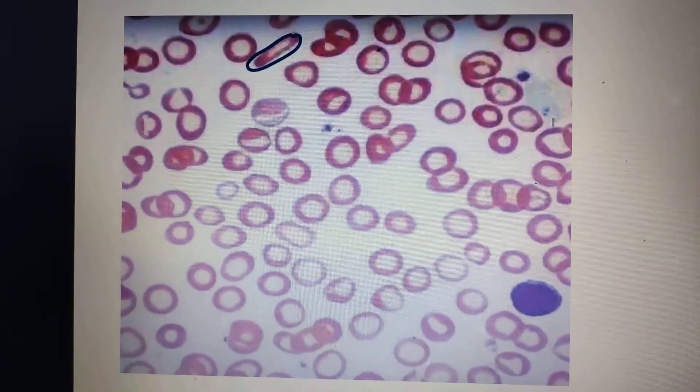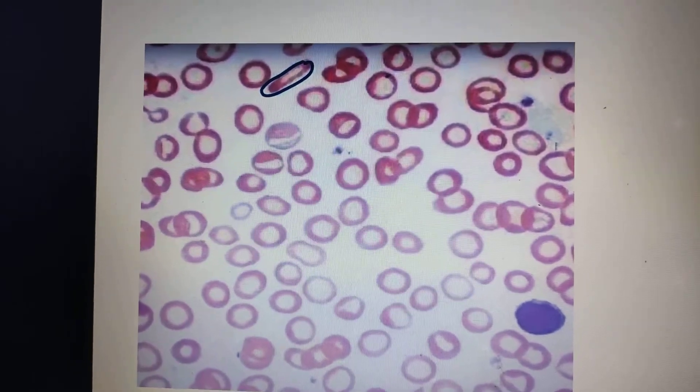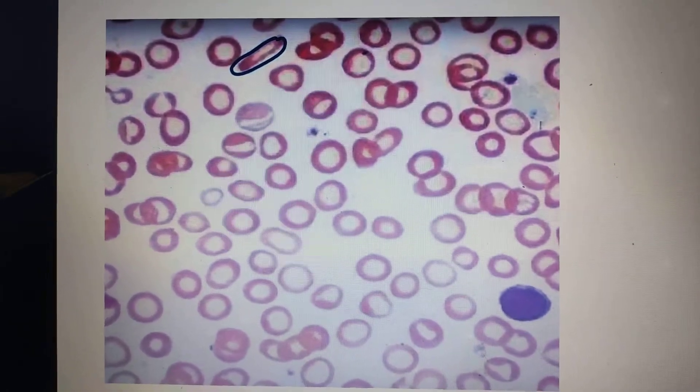Hi guys, welcome back. In this video we shall be doing a very quick video about the peripheral blood smear of an iron deficiency anemia. Whenever you see any peripheral blood smear, please always check out the size of the RBC with the lymphocyte.